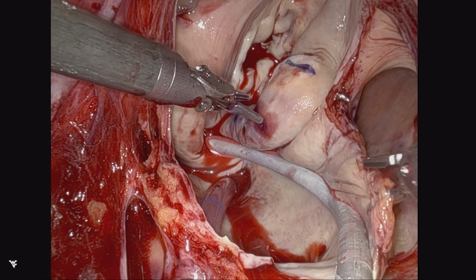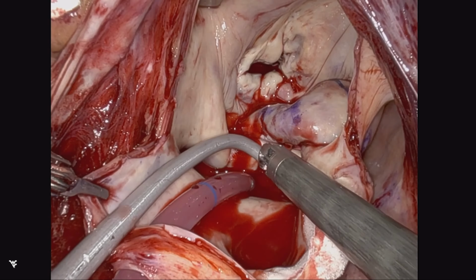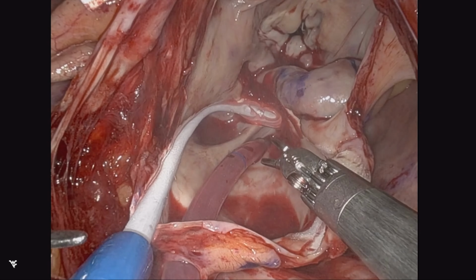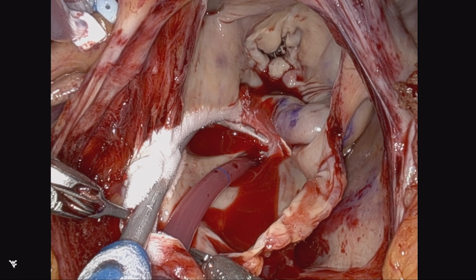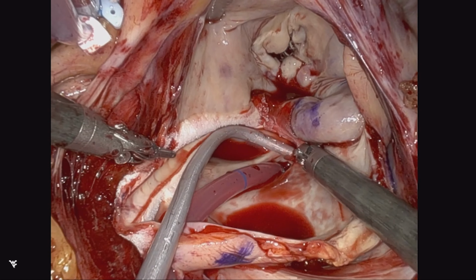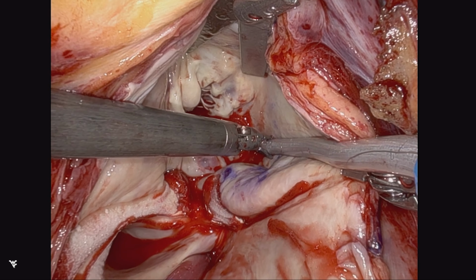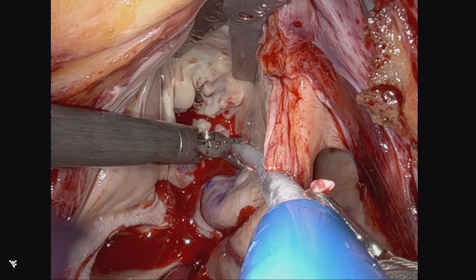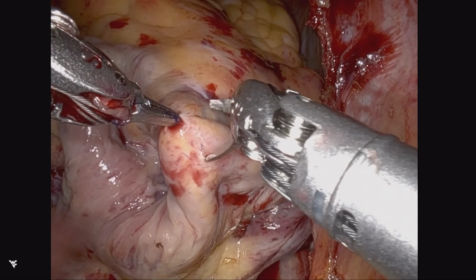You can see this demonstrates how we can avoid tissue gaps with a robotic technique, as we've demonstrated in previous videos. Again, inferior box lesion after the epicardial coronary sinus lesion, followed by superior box lesion to avoid Bachmann's bundle. And then the mitral line. And then approaching the right atrial lesions in the presence of a pacemaker.